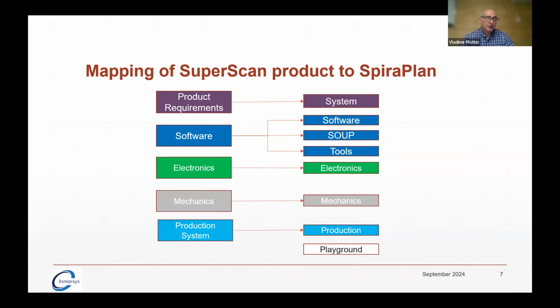So even if you're using software from other parts of your company, say you work in a really big company, and some other department develops software within the same company, but it wasn't done to 62304 standard, you treat it as a SOUP. So for SOUP, you're creating your own set of requirements, what they need to do, how they need to operate. You get the functional, software, hardware, performance requirements. And then you need to validate it for use. You also need to do your known issue set analysis. So if you get the known issues, the bug list from the manufacturer, it's great. If not, it makes your life a bit more difficult, but such is the life of third-party software.